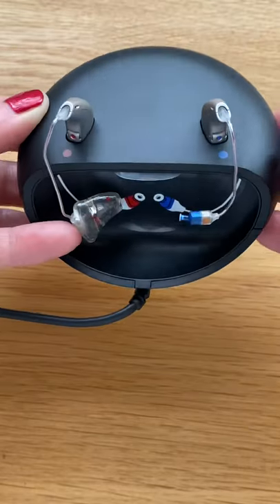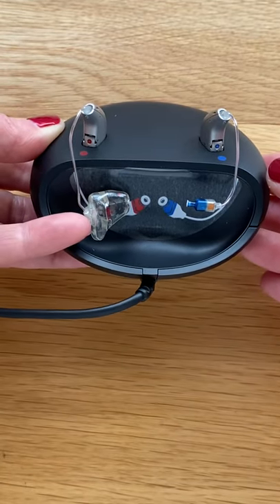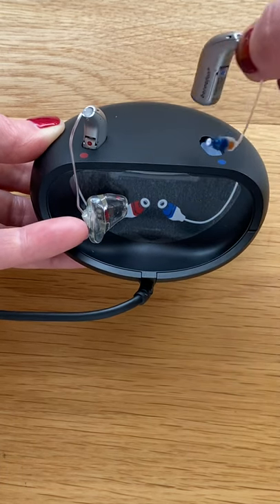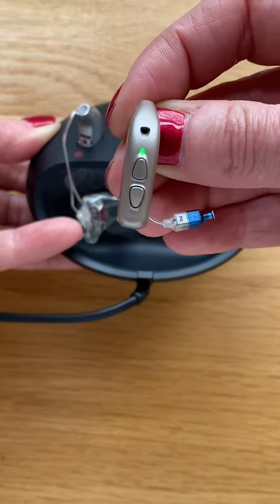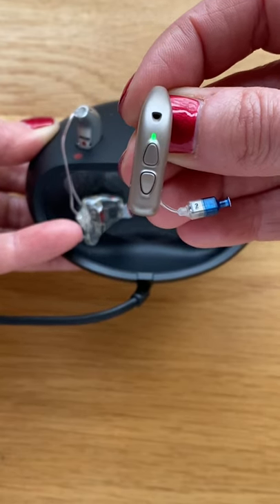When the instruments are docked in the charger, they are automatically switched off, and when they are undocked from the charger, you will see this green light appearing, which means that they are switched on automatically by being undocked from the charger.